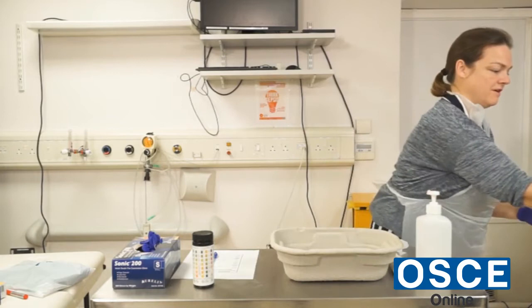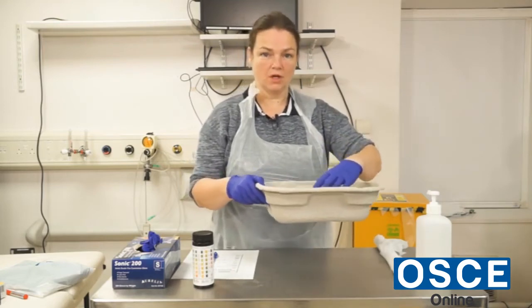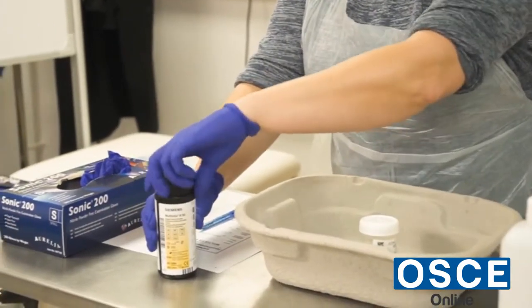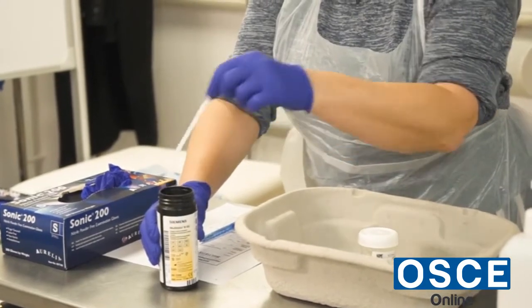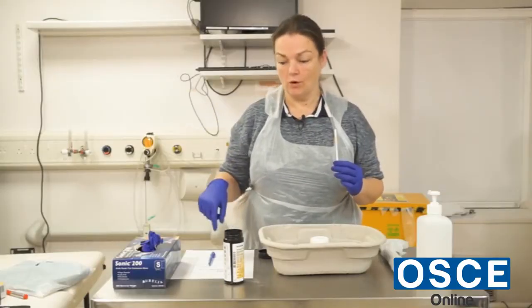Thank you, Sarah. So I now have the urine back, and I would place that into the tray, just so that there's no splashing everywhere. So I'm going to take the urine stick, and I'm going to keep it in my left hand, because I am going to write with my right hand and keep that dry for writing on the form.